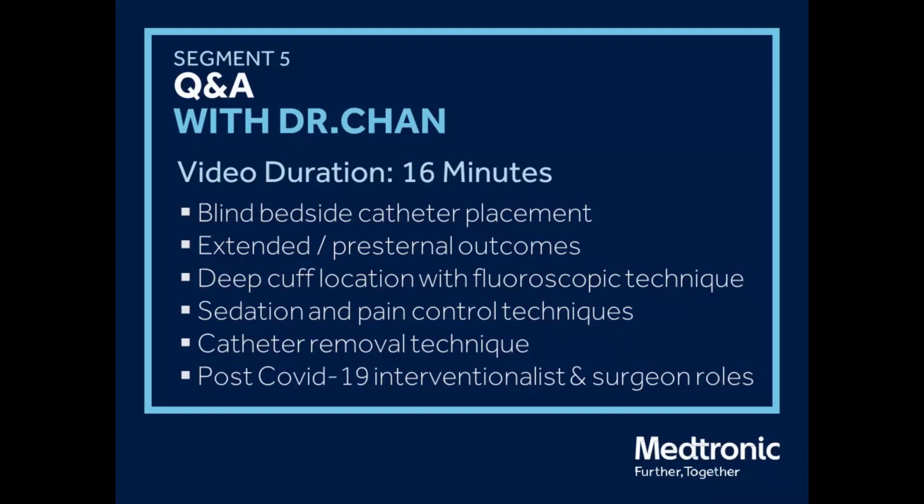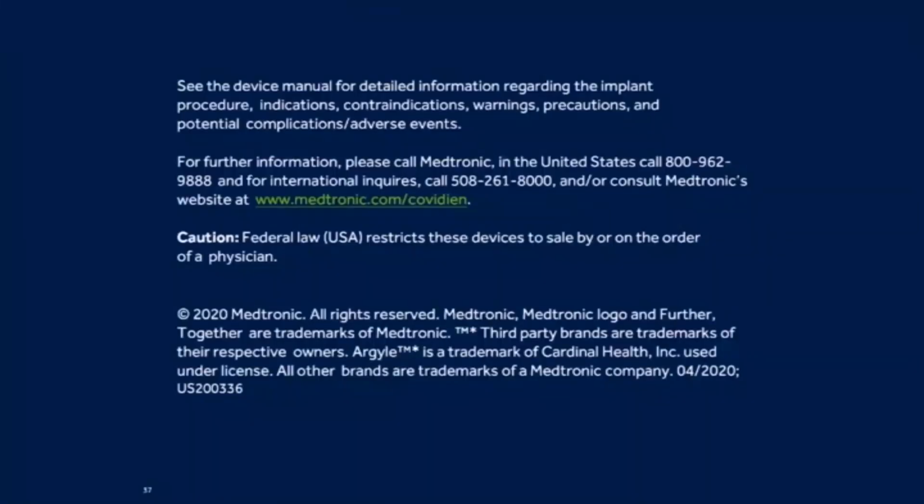But again, it's patient preference, and in obese patients, they may have trouble in terms of pannus, etc., connecting and disconnecting where that catheter lies. And so a lot of times in those patients, we'll just do a modified pre-sternal.